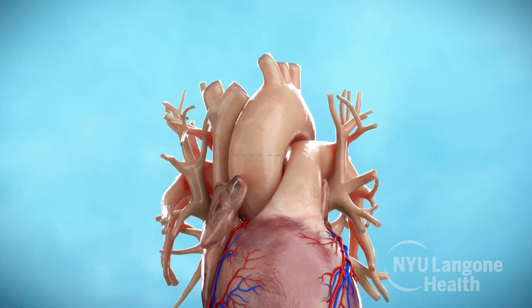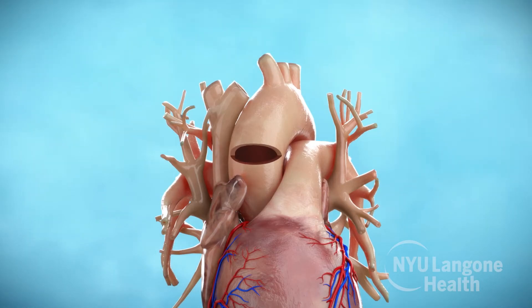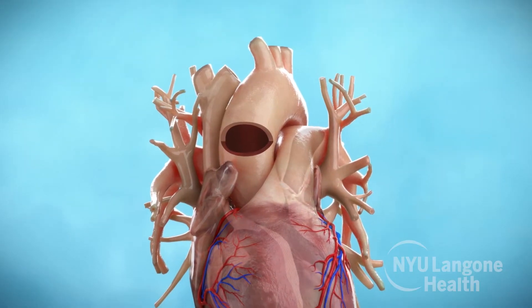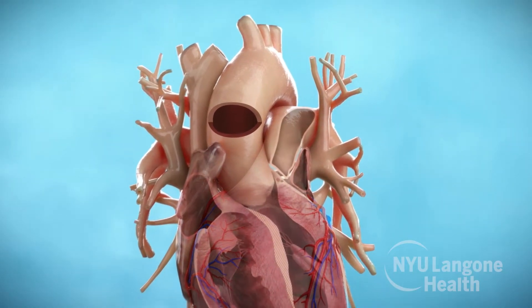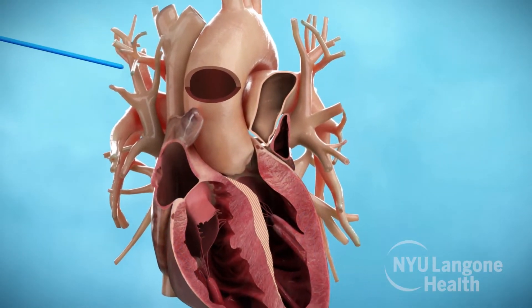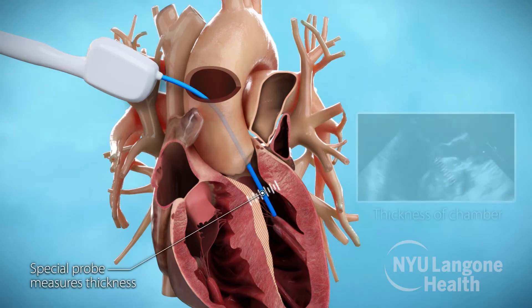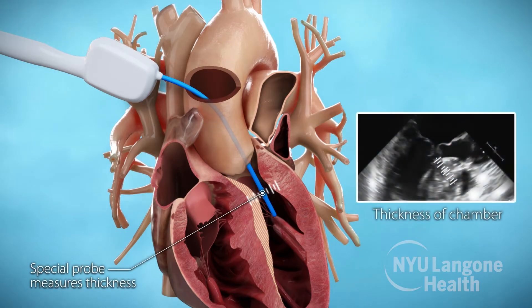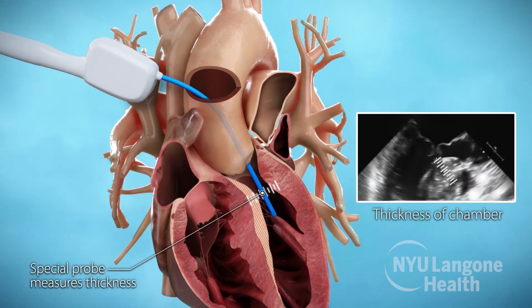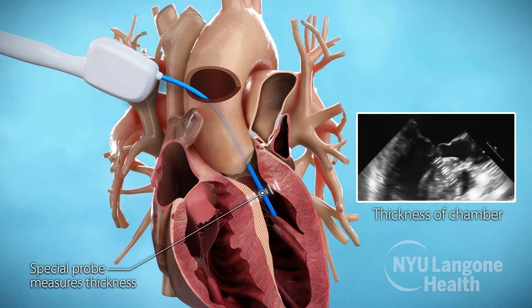First, the surgeon makes an incision in the aorta, just above the aortic valve. This allows access to the ventricular chamber. A special probe is used to measure the thickness of the septal wall. The surgeon uses this measurement to determine how much tissue to remove.